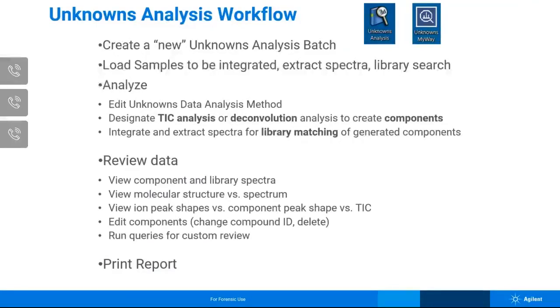One of the key features, however, is that when you create a batch, you normally want to create it in the directory where your data files are located. That doesn't preclude you from importing data files from other directories, but it does make it less confusing when you want to go back and look at the unknowns analysis batch and where those data files are located.